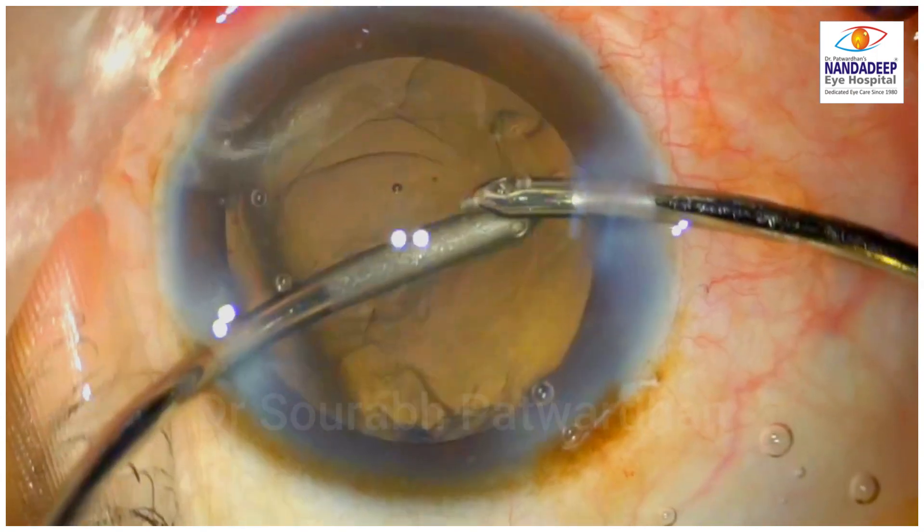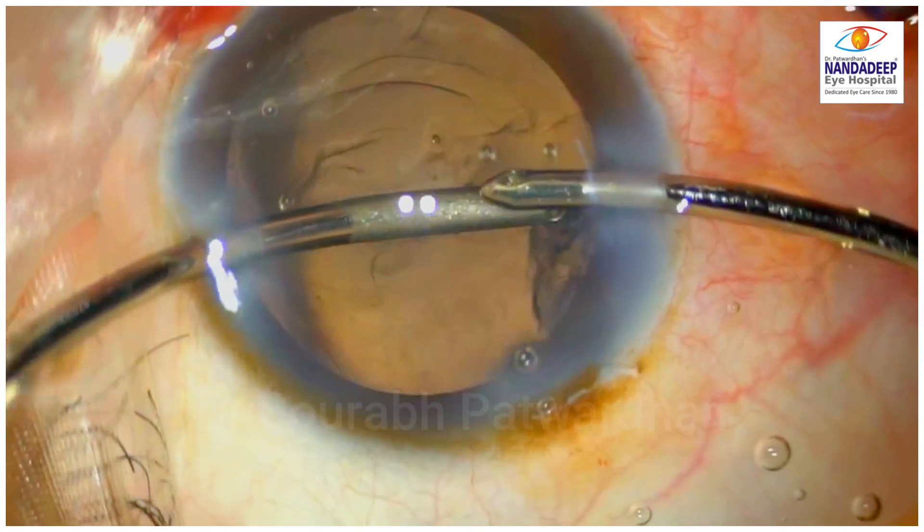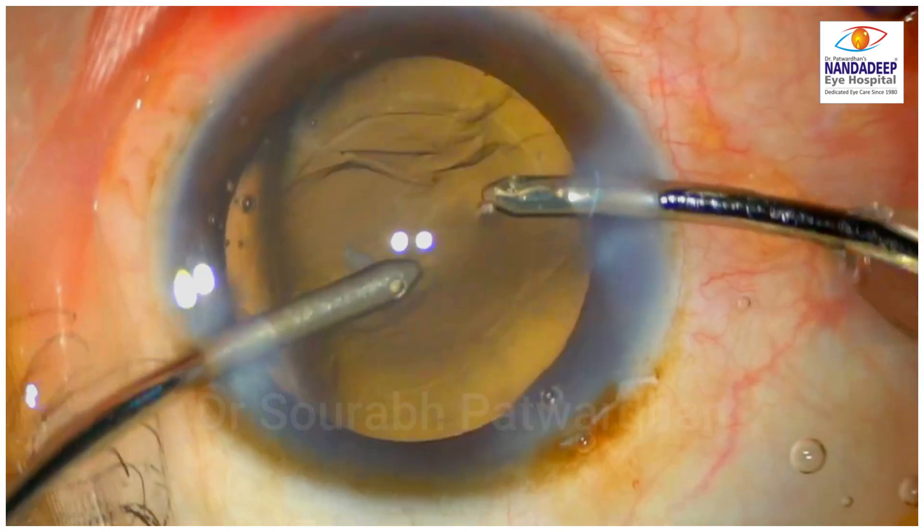And as you move this cortex tangentially, it gets over the CTR — you can see here, it comes out over the CTR. So I think it is not very difficult.